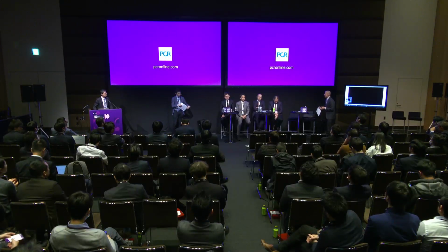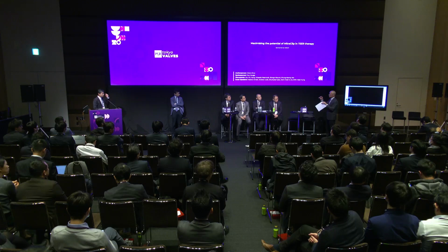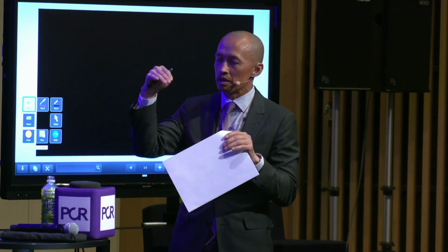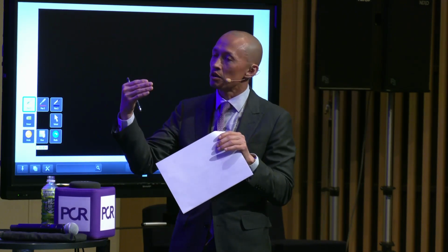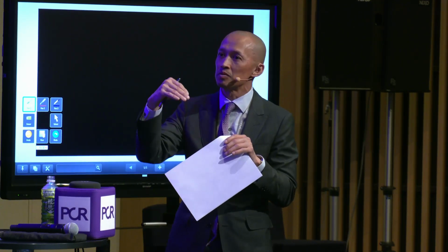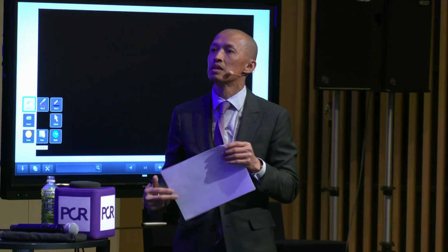That was a great case. What I really like in your discussion was orienting the clip trajectory relative to the posterior leaflet and the coaptation zone. A lot of times, depending on how the leaflet's tethered, it's hard to get the device under the free edge of the posterior leaflet. And sometimes we need that aorta hugger, as you're saying, adding minus, or sometimes a different transseptal, to get that free edge under there. How often are you adding minus to kind of match the posterior leaflet?